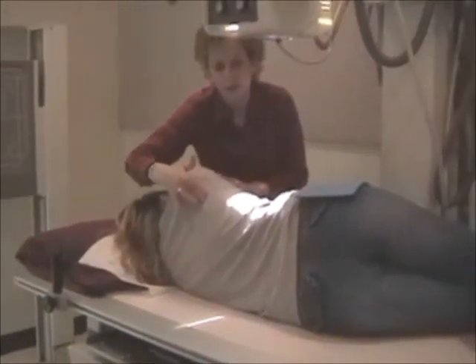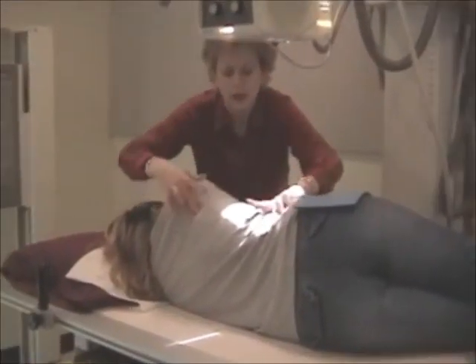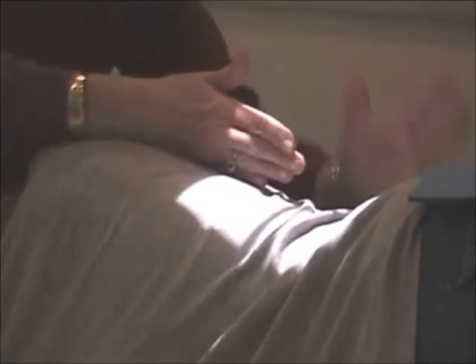I'm going to use the tip of the scapula, iliac crest. We'd go halfway and then down 1 inch. This would be for sthenic. And then mid-coronal plane. I want to be a little anterior to it, but from my view now, I'm actually x-raying tabletop, so I'm not going to move her forward to truly set the 1.5 inches anterior to the mid-coronal plane to the center of the film.